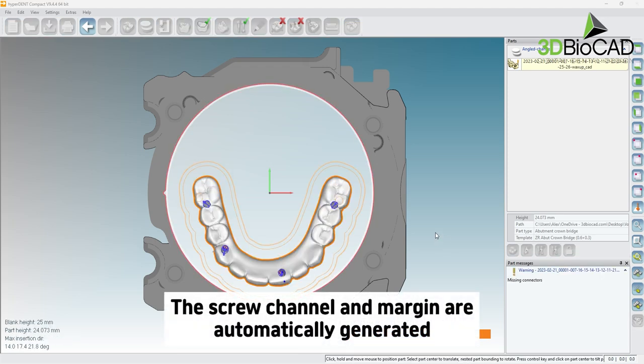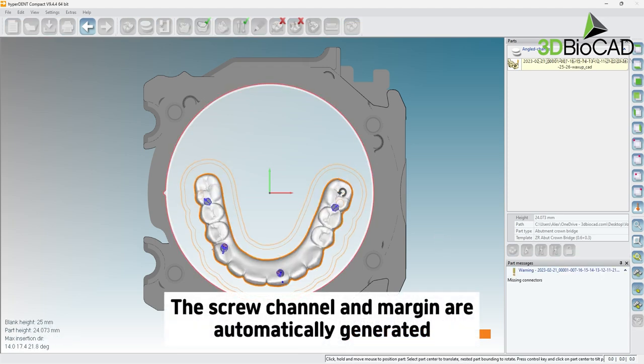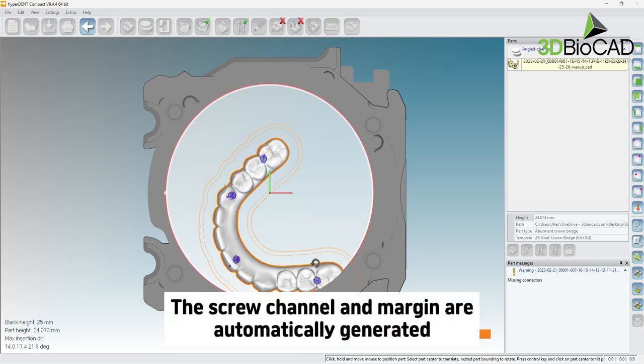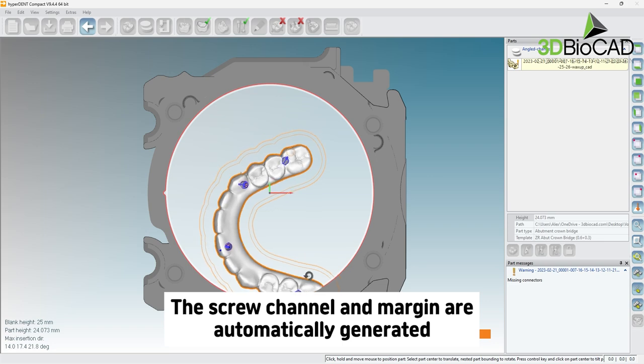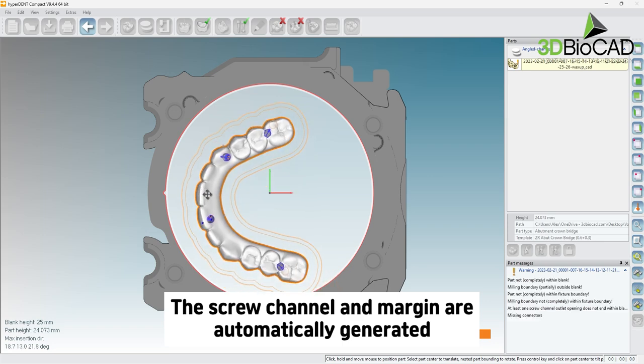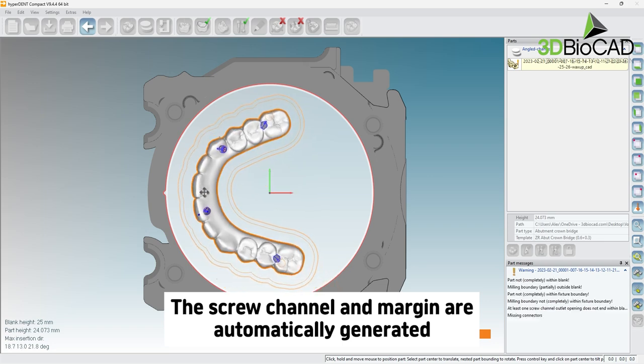The design will populate in the blank automatically with the screw channels and margins. Now you can rotate and move the file freely.